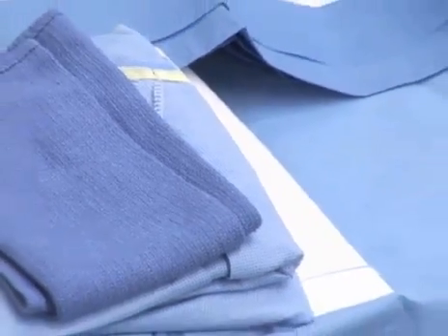Strike-through contamination occurs when a drape becomes soaked during surgery and solution penetrates to a non-sterile surface. Whenever possible, use only impervious drapes. Drapes fitted with a pocket reservoir and drainage system are used for cases in which extensive fluids or bleeding may cause strike-through. Plan ahead for draping.